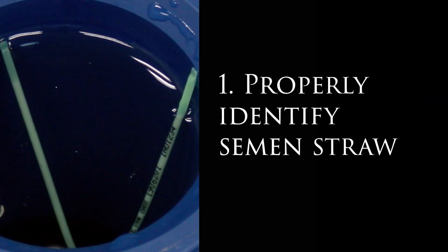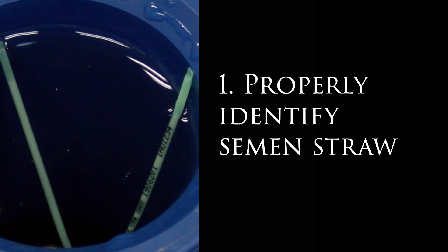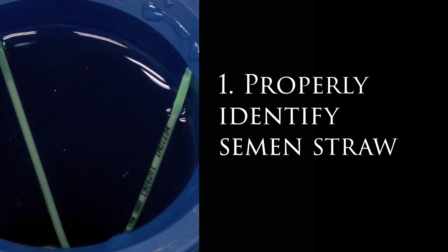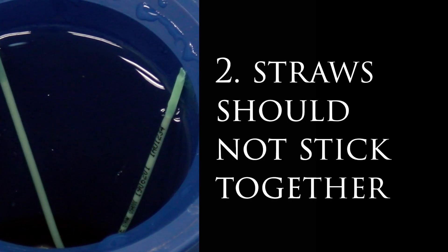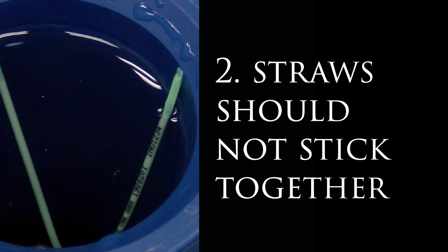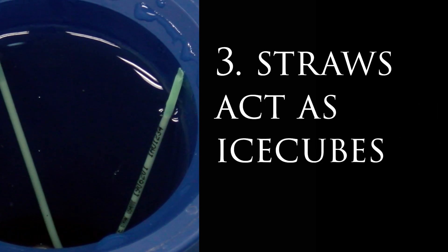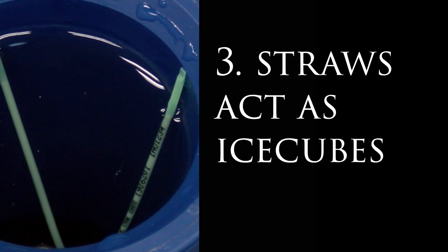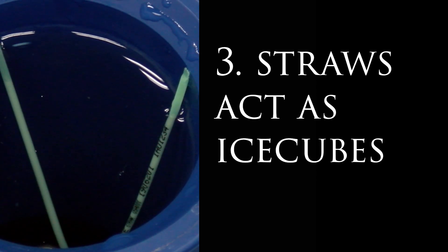First, it is critical to keep straws identified within the straw bath to avoid confusing or using the wrong straw. Second, straws should not stick together in the thaw unit as this can cause uneven or incomplete thawing. Third, use caution as to the number of frozen straws placed into the unit at any one time.